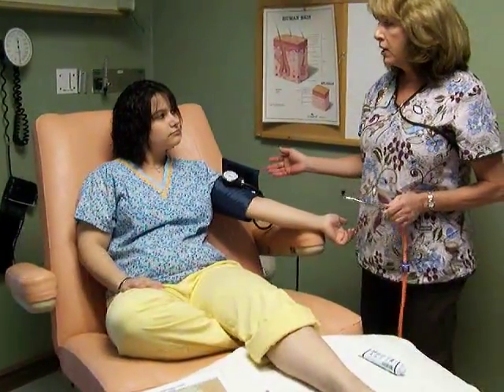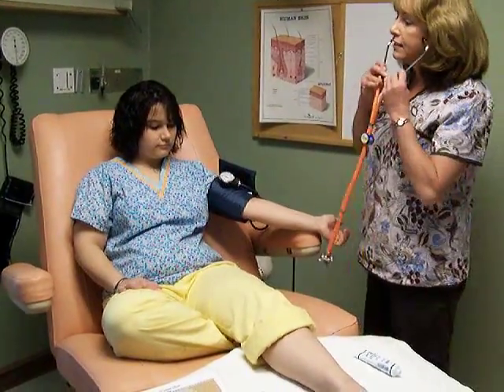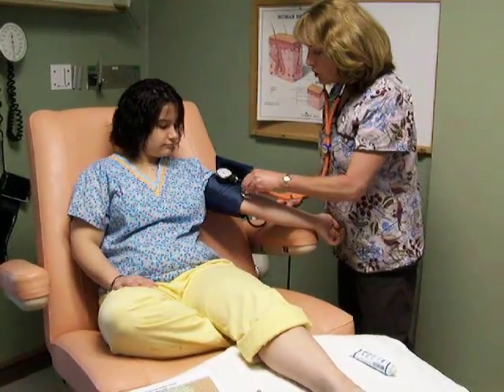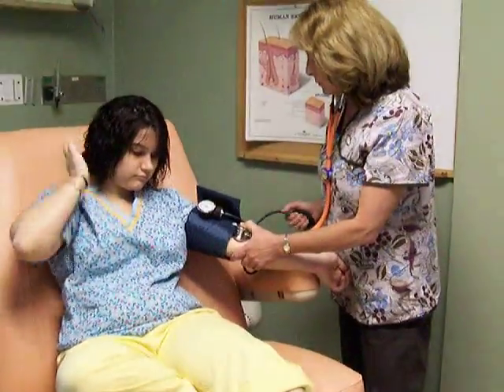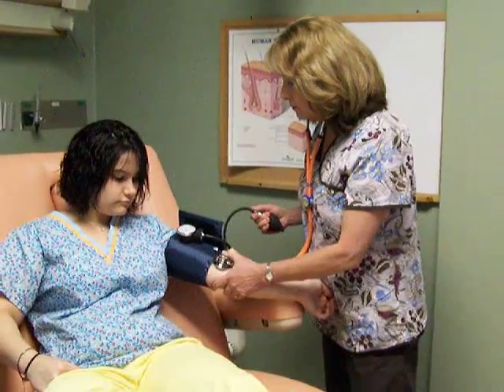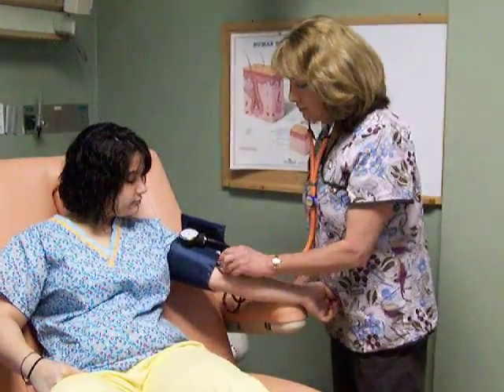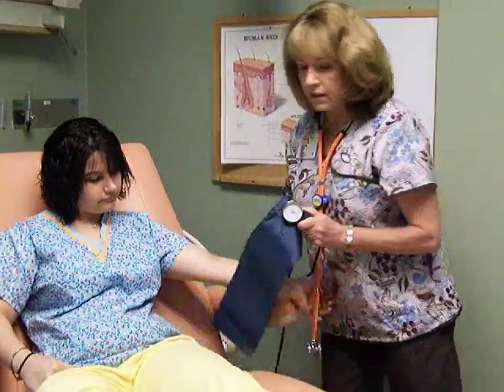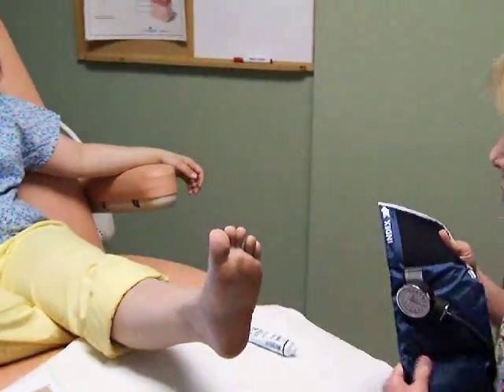On the side of the wound, you just use the stethoscope and manually obtain the systolic blood pressure. The brachial systolic blood pressure obtained here is 108.